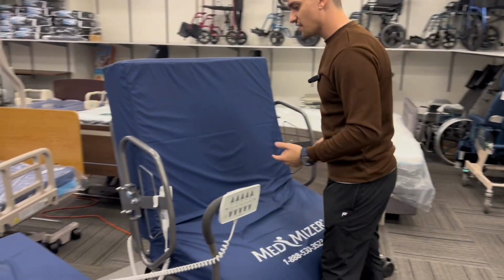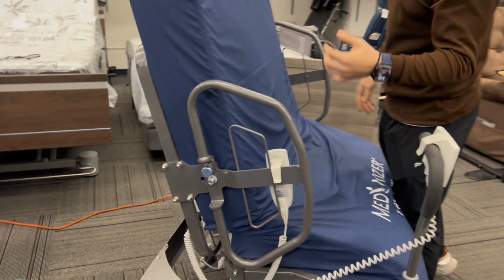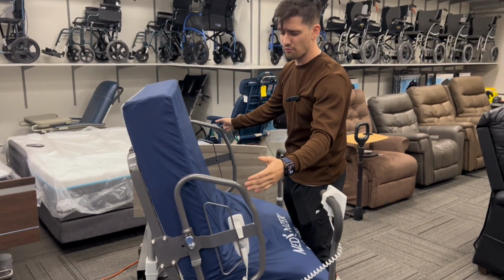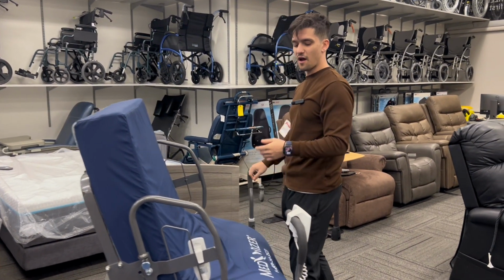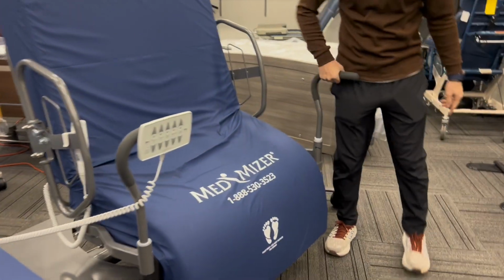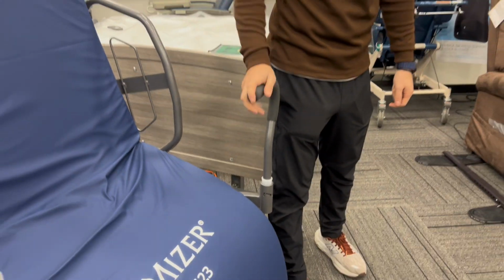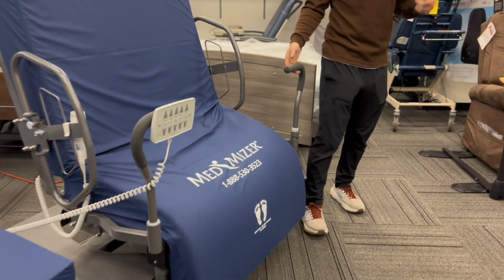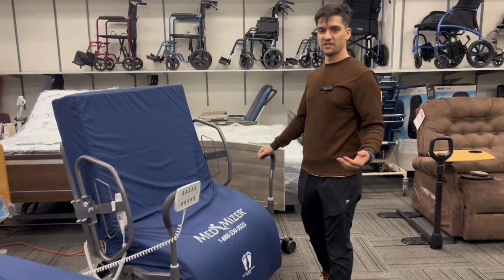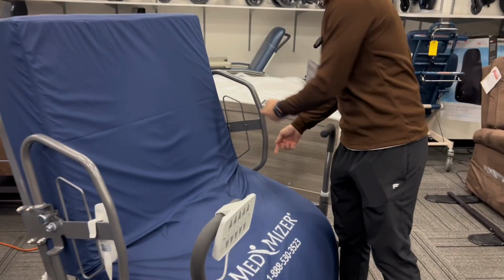The next accessory is going to be the side rails. So right now we have the side rails at the head section of the bed. This is going to be your standard half side rail, which usually comes with the bed. People would always have at least this railing. The more optional railing is going to be these pivot bars here, which are able to swing and straighten out or tilt in if you're going to use them. You can get one on each side, just one if you only need one. Or if you're someone that just needs more safety, you're able to get additional rails that look slightly smaller than this at the foot section.